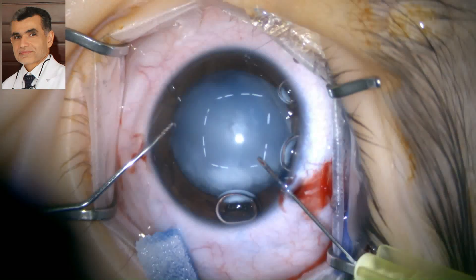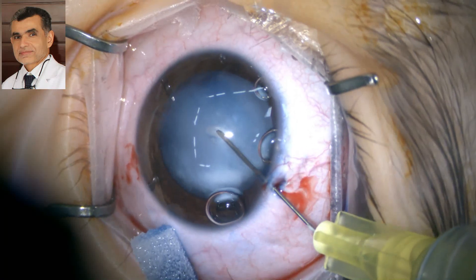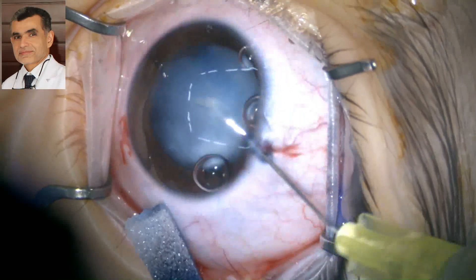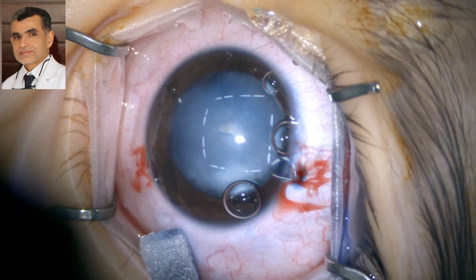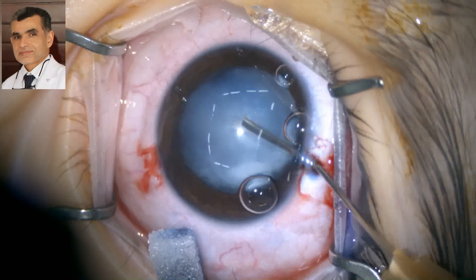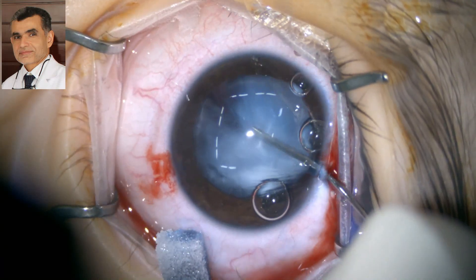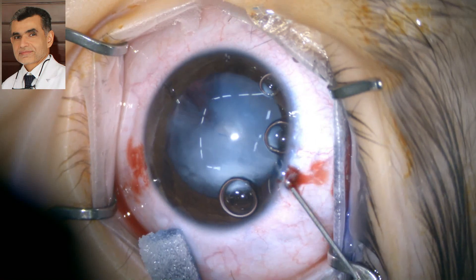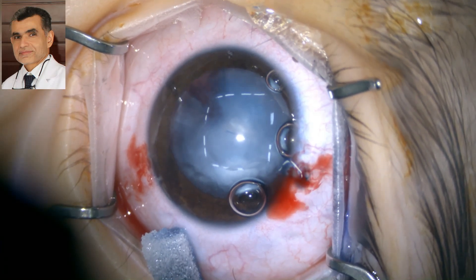A cohesive viscoelastic is injected inside the eye. This tool was used to start the capsular access. White matter actually came out of the capsule — just like a hypermature cataract in adults — so we had to aspirate some of the lens matter from inside the capsule using a cannula.